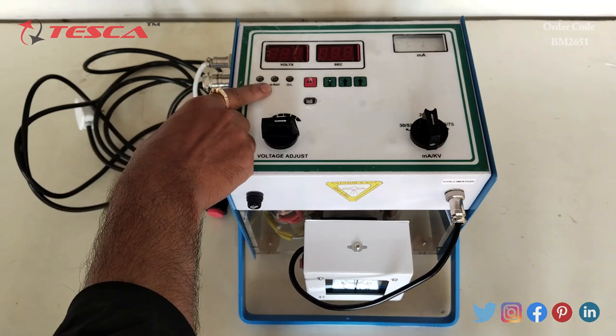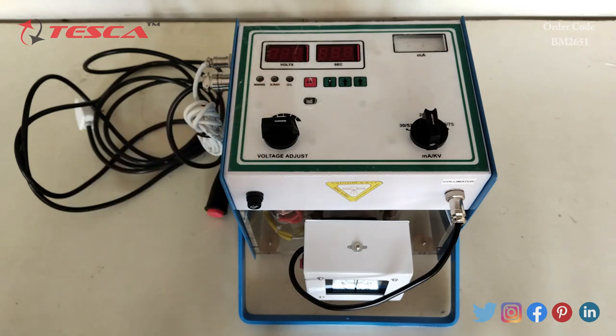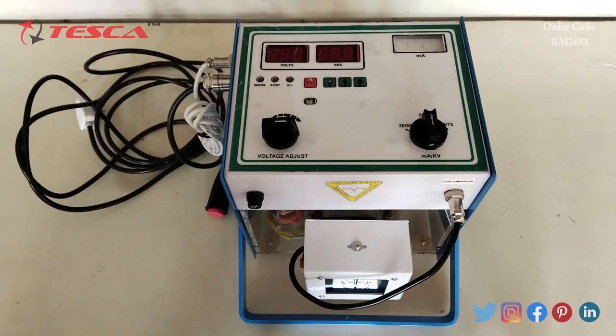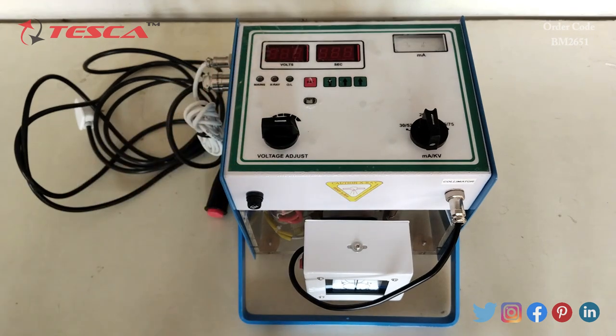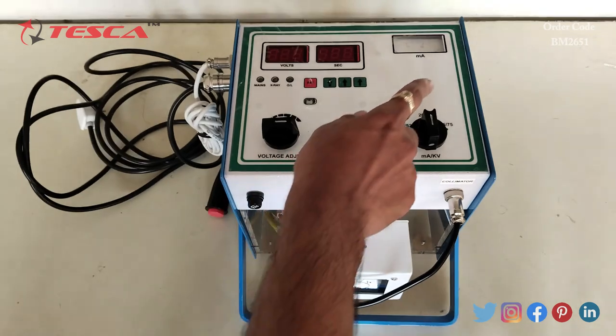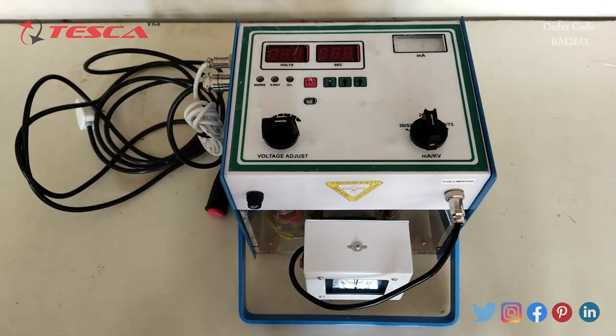This is the X-ray indication LED and this is the O/L LED. When over-voltage is present, the voltmeter will show 'OUL', meaning over-voltage, and at that time it will not operate. The milliammeter on the top right corner of the control panel indicates the X-ray tube current passing through the tube during the exposure.